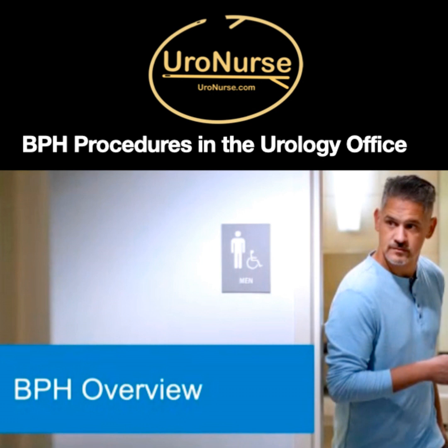We do have a question from Melanie Waddlington. We do both Rezum and Urolift. We are finding that a few years after the patient received a Urolift, they are back for a Rezum. Our experience has been that the prostate keeps growing over the Urolift clips and becomes obstructive again. And I have seen that myself too with a few patients that have had the Urolift, that it temporarily works.